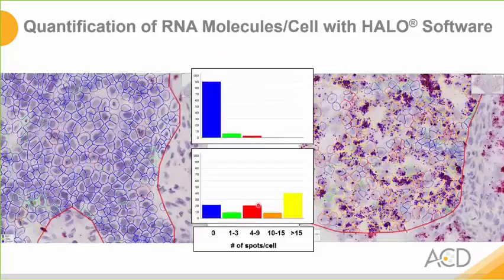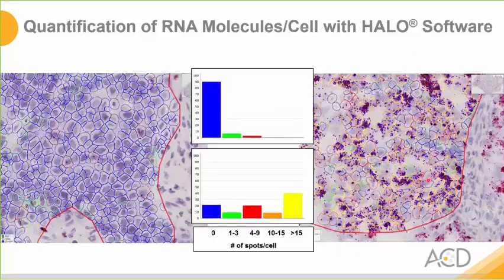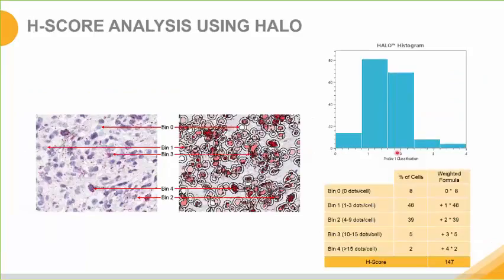The HALO software can perform similar analyses to SPOTSTUDIO on singleplex assays, but also allows for more complex duplex analyses. So in this case, you can see the red chromogen, as well as, a little bit harder to see, but there's both red as well as brown chromogen. So it allows for quantitation of duplex assays.